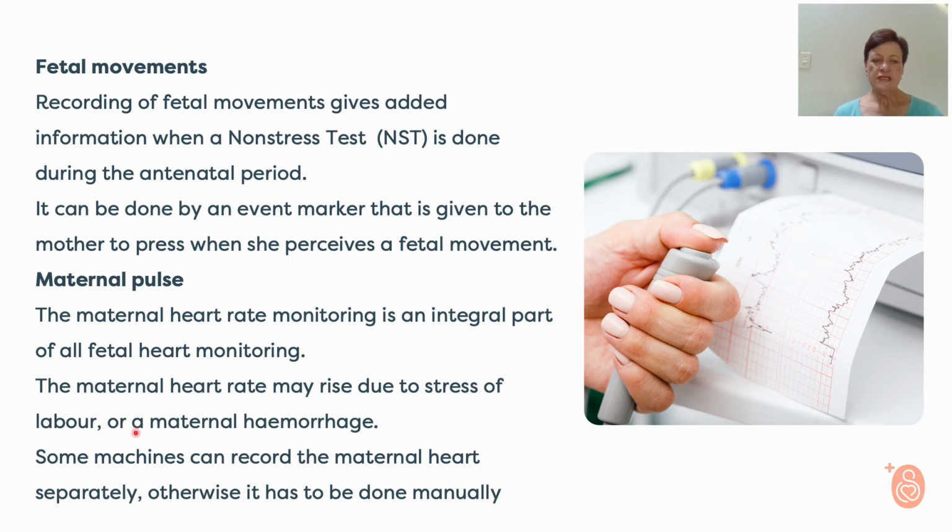Now, in some machines, we can record the maternal heart rate separately, and it's presented on a graph, and I will show that to you also just now. Or if we have a little bit of an old-fashioned machine where we can't record the maternal heart, it has to be done manually.